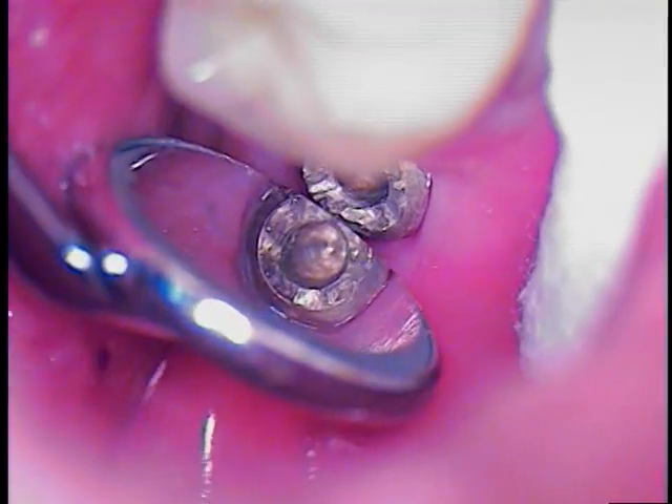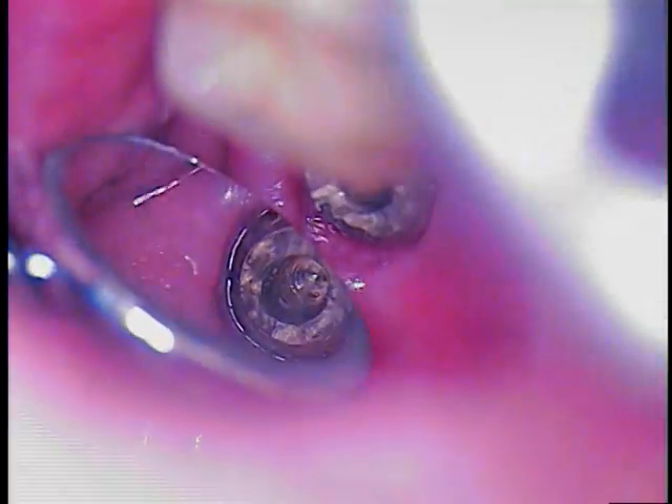We may have to switch to a smaller mirror. This is our micro mirror — about 11 millimeters in diameter. I have to put a bite block in there. Close down on this for a minute.